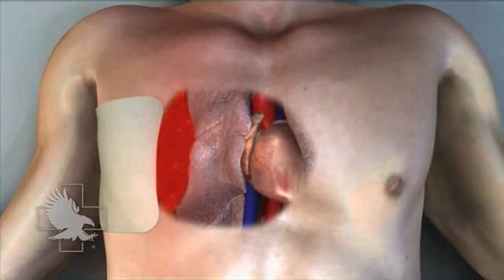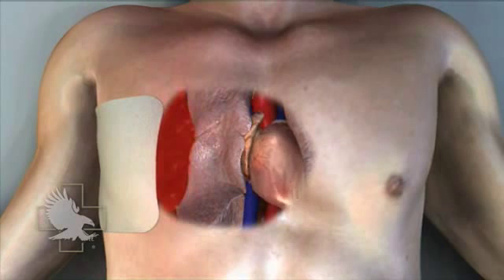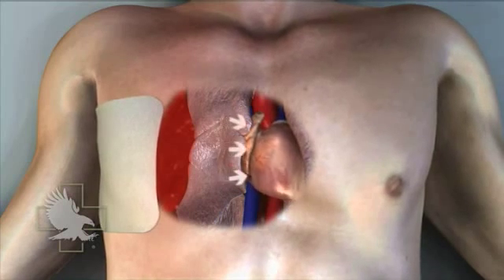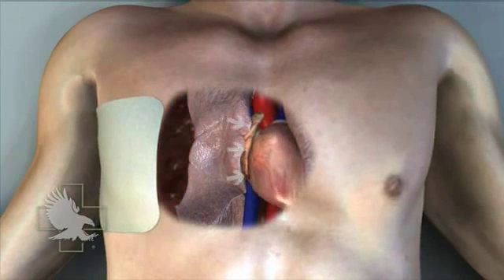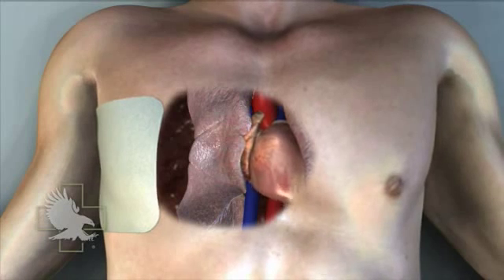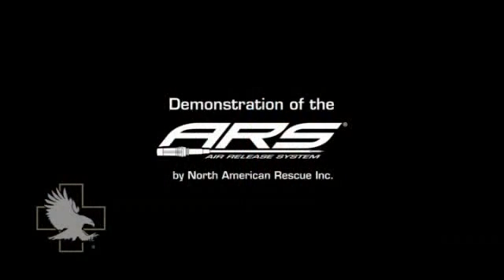As the air pressure in the pleural space increases, a tension pneumothorax can develop, causing respiratory compromise and shock. This life-threatening condition must be treated before it creates an excess pressure that compresses the heart's ability to pump blood effectively. The rescuer decompresses this tension pneumothorax by performing a needle thoracostomy, commonly referred to as a needle chest decompression.